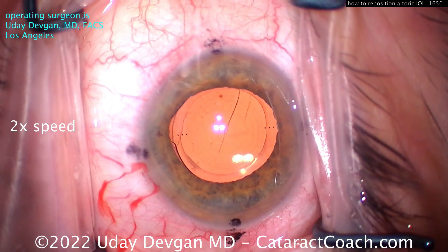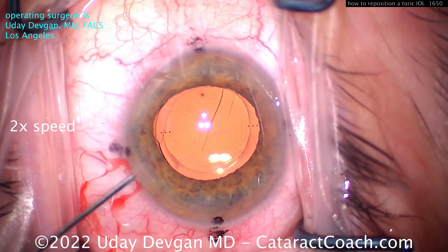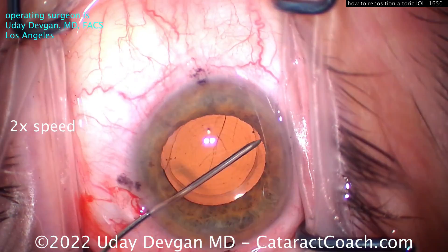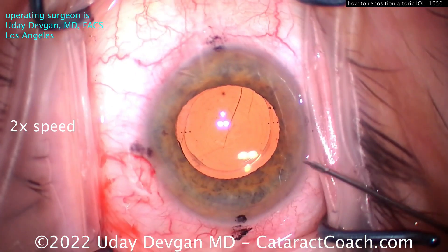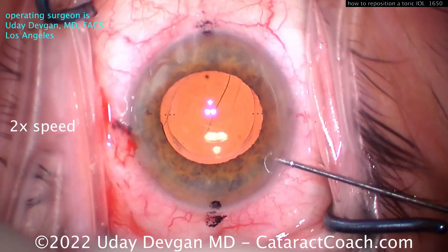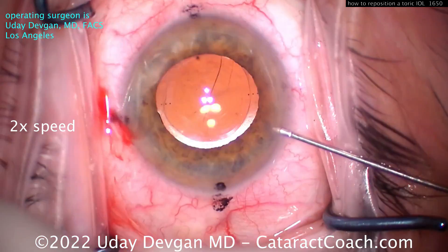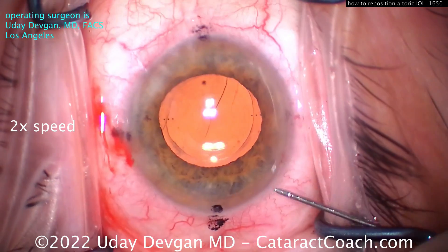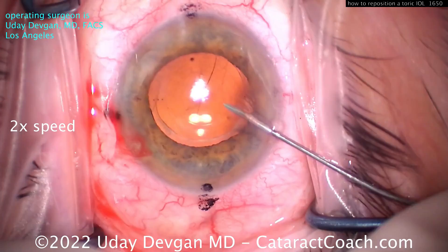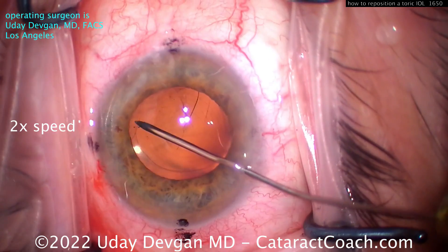If you check right now, the IOP is probably in the low single digits. Going in, we're going to use a needle — put the needle bevel down on your dispersive viscoelastic — and you need to get that gently under the capsule edge in both directions. When you get under there, inject a little aliquot of viscoelastic because that's going to help tent up that anterior capsule rim.